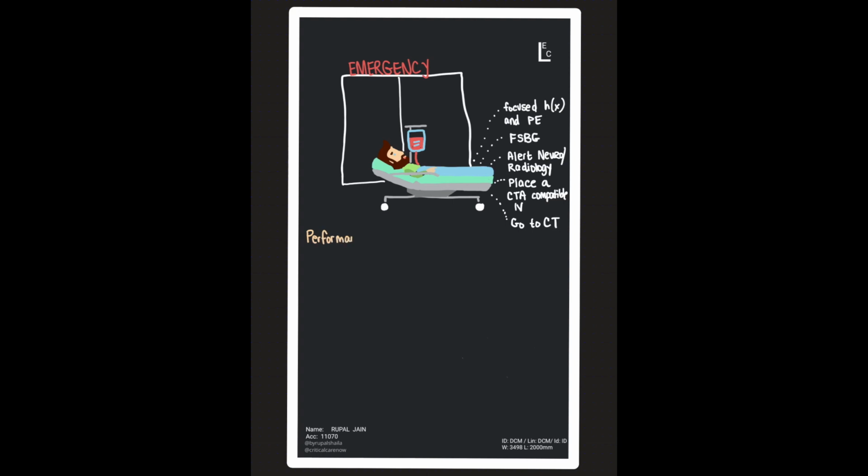Now, before I jump into the details of how a CT perfusion is performed, let me preface by saying that this is just one of several protocols out there. I wanted to review at least one protocol in detail so you can hopefully understand what this test entails and why it can seem to take so long.